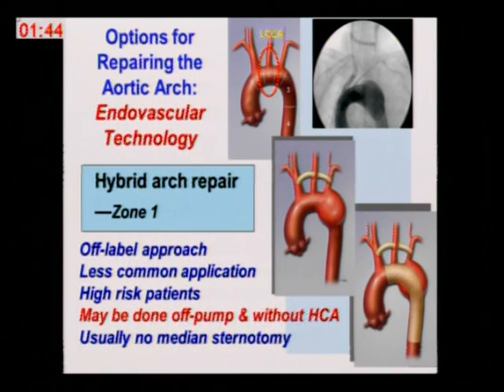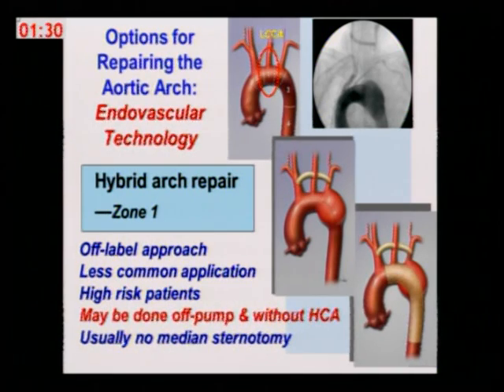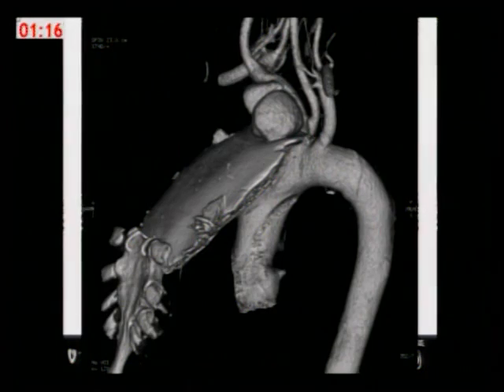This is something that we rarely do, these carotid-carotid subclavians and carotid-carotid bypasses. We would prefer, in these circumstances, to use a branch off of the ascending aorta to the head vessels, as I showed you in the previous slide. But in patients with a hostile mediastinum and or other significant cardiac issues, this can give you, as Mark mentioned, some additional length between the left carotid and the innominate artery, but by and large in most patients, that doesn't buy you a lot of space.